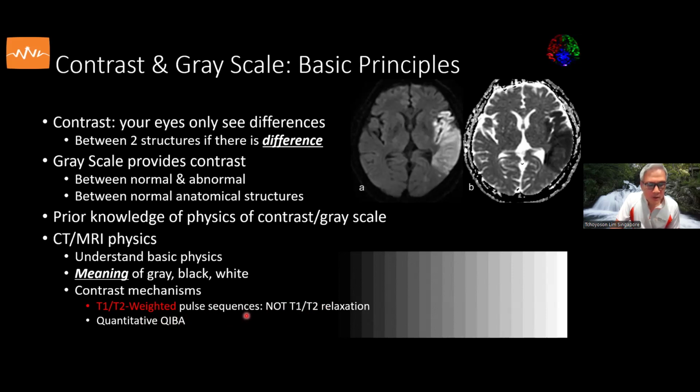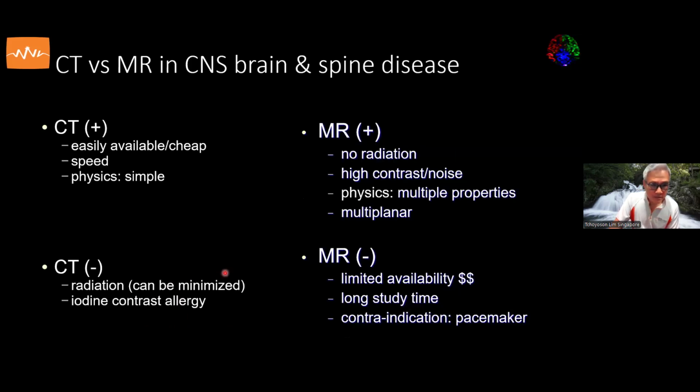So primarily, we mostly deal with T1 and T2 weighted and diffusion weighted images rather than the pure physical quantification in the clinics.